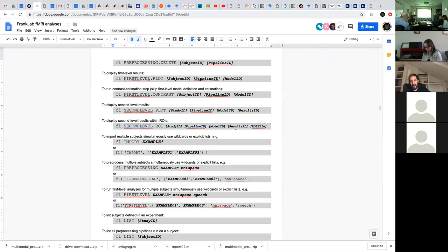Because for the most part, and there is a little caveat here, the general linear model that is run at the first level analysis is a linear model. And that means that whether you aggregate first and then compute the GLM, or whether you compute the GLM and then aggregate across voxels, you get exactly the same. But that is not totally true. There is one minor thing which has to do with the estimation of the temporal covariance, which makes those two analysis streams different.